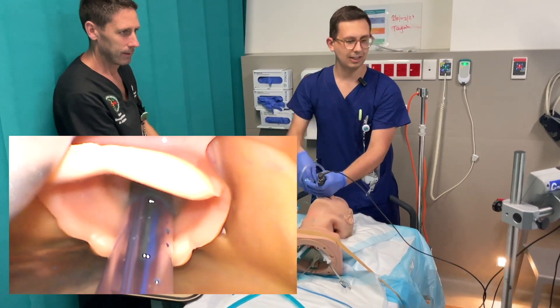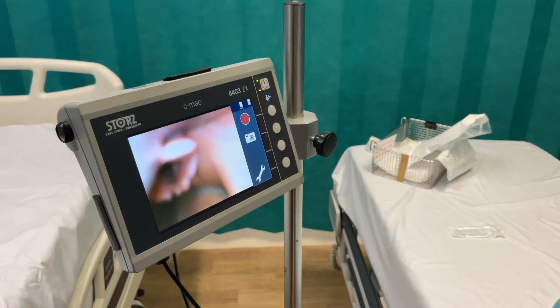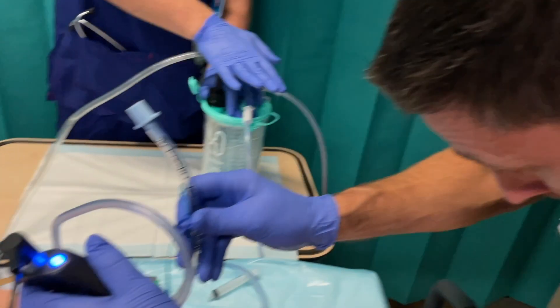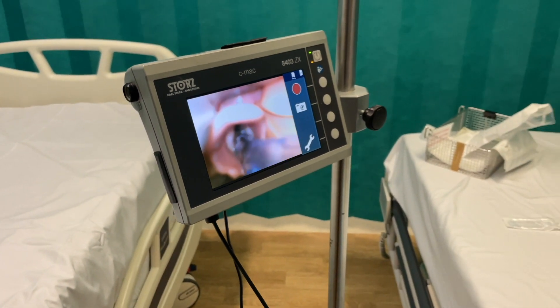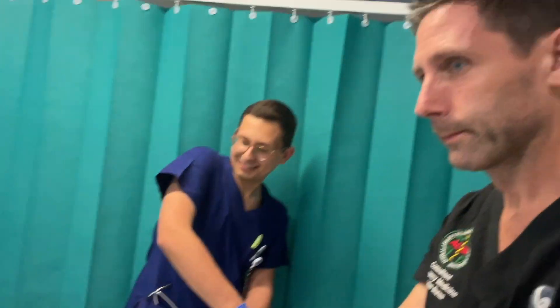And of course we would definitely need to suction the tube as well, or just pop a bronch in there. That's pristine. I know. Thank you Luca. And thank you Jim DuCanto.